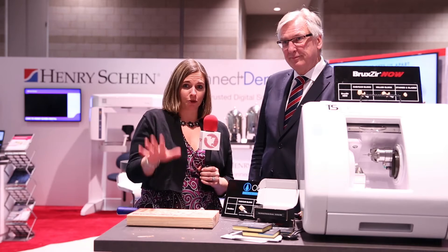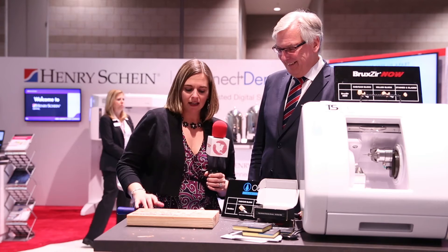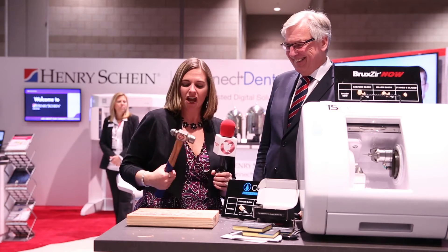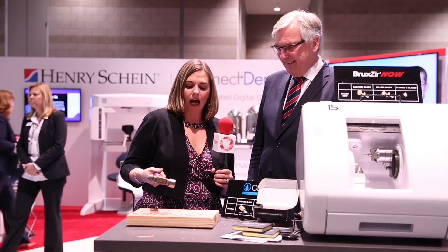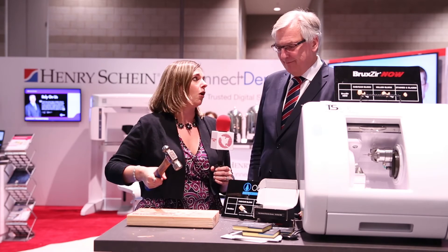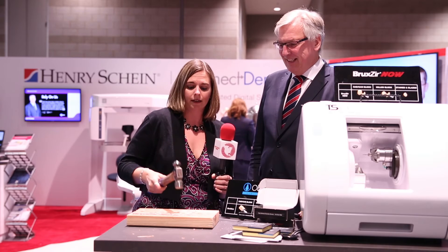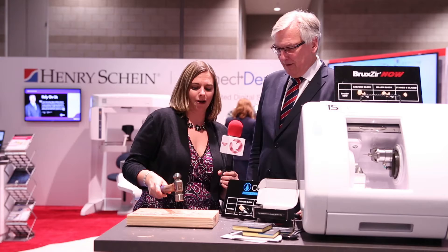Well, congratulations — this is very exciting. And you can come here to the Henry Schein Connect Dental Pavilion and do what I'm about to do. This is totally legal. I don't have to sign any waivers, right? As long as you're careful. Well, here goes nothing. We have a hammer, and we have the Bruxer crown going into a piece of wood. The idea is that it cannot be broken — I can hit this with all of my might. Here we go.